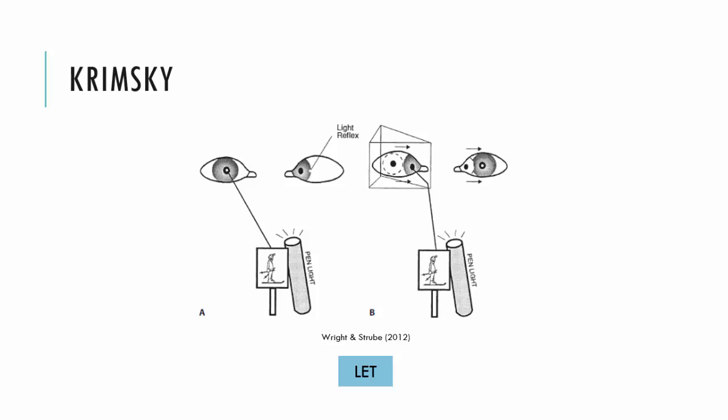Now, I've just put this image here to show you that little bit more clearly what to expect to see when you put the prism in front of the fixing eye. So here in image A, we have the patient fixing with the right eye, and they've got a left esotropia. The prism has gone in front of the right eye, and the dotted line represents the original position of the right eye. And what we can see here is this was the fixing eye, and as it tries to continue to fix on the target with the base out prism, it will start to deviate inwards. And in going inwards, the left eye will make conjugate movements outwards. So here's the original position of the left eye, where it was in, and those conjugate movements to move with the right eye will result in you centralising that corneal reflex.